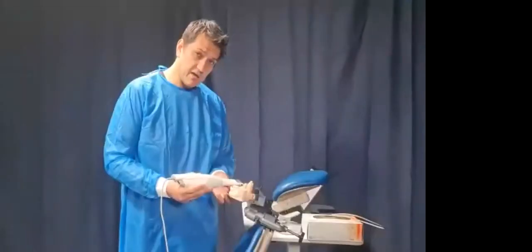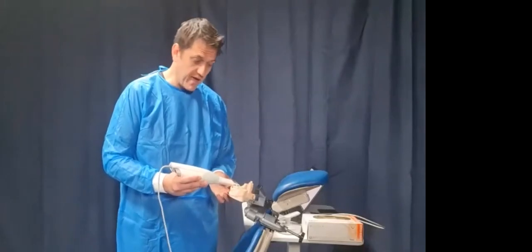But what I would do is I come around to this side, where your cheek would be here. So I retract the cheek with my scanner. I use my scanner to really retract it, and that makes the really mobile mucosa quite firm. Well, it's scannable in a way. Then as I retract, I roll, and I use my scanner head to push down, basically to push down and retract for me as I image. Thank you, that'd be great. That's really the strategy I did use for this case.